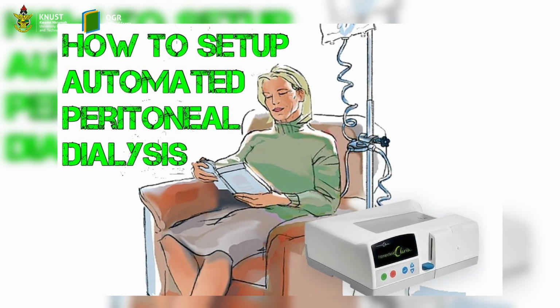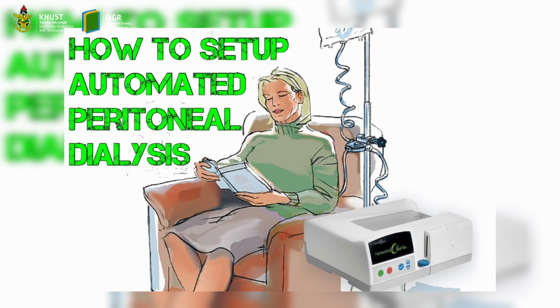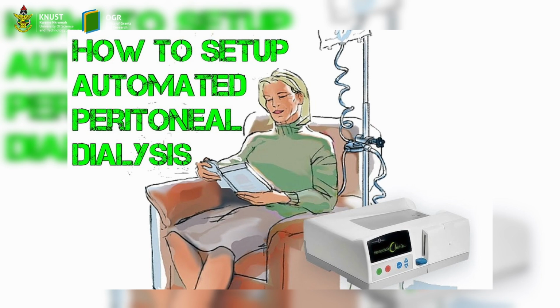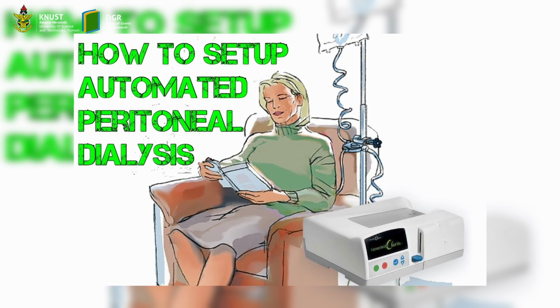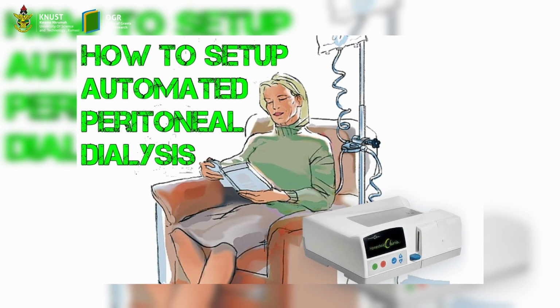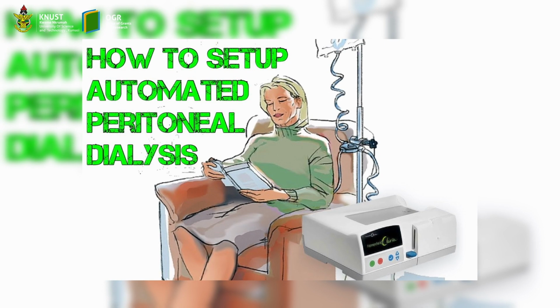When it's done, they close the valve. That's manually done. They switch the valve for a dwell time, which depends on the peritoneum cavity of the patient, so it can go from 30 minutes to an hour or more, up to 5 hours.